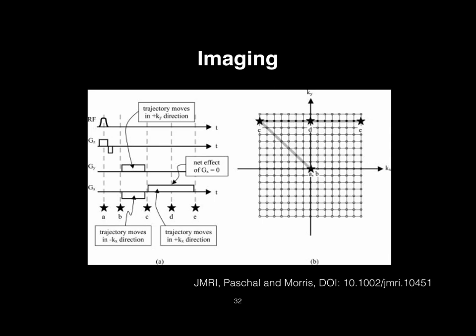So first off, you turn on a gradient where you want to select your slab of tissue, your slices, and you have your RF that resonates with whatever frequency you create at that location. These 2 points actually leave you at the center of k-space. So the starting point of k-space is kind of equilibrium, where you put your sample there, things are laying down, like at rest.